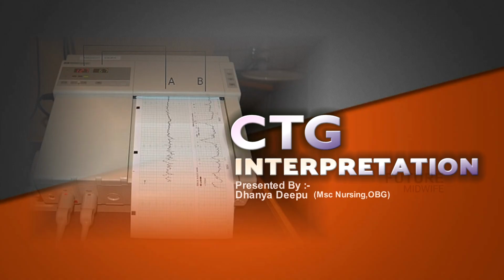Hi all. Today's topic is CTG interpretation. This section will be the continuation of my last video. My last video was basic information about CTG. So those who have not watched the basic information of CTG, please watch that video first. Then it will be very easy to understand the CTG interpretation. So without wasting time, we can move on to today's topic, CTG interpretation.